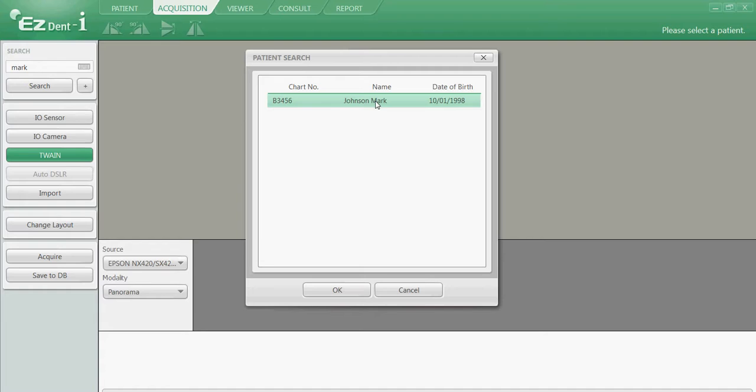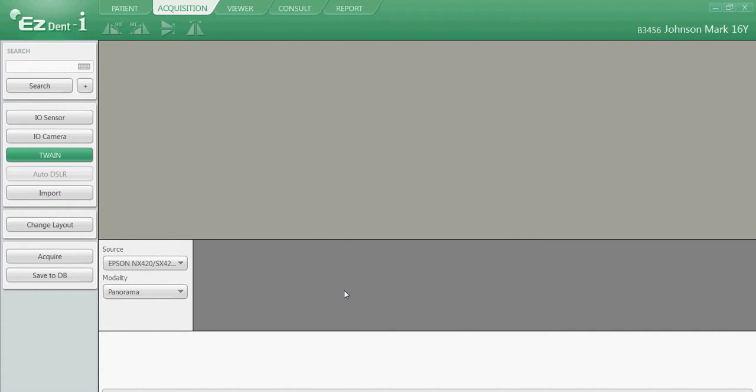If this is the correct patient, left click on it once, and then left click on OK at the bottom of the window. Verify this is the correct patient by identifying the chart number, name, or age.